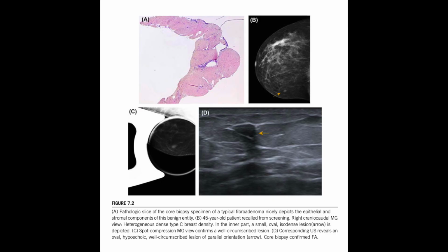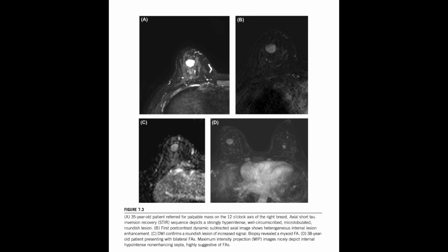Which means the opposite must immediately raise a red flag. Immediately. Any descriptor that suggests chaos or aggressive growth, that's a problem. If a lesion is described as irregular in shape. Or spiculated, I've heard that term. Exactly. Or if the margins are irregular or spiculated, so they look like little spikes radiating out, that finding instantly bumps it into a suspicious category, a BI-RADS 4 or 5. And that almost always means a biopsy. It almost always mandates tissue sampling, yes.